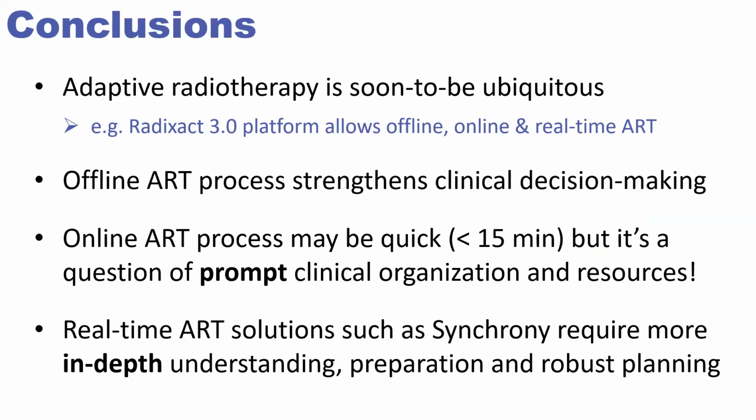So in conclusion, what I wanted to say is, as we've seen, it's soon to be ubiquitous. We're a small center in Lugano, and I have the capability essentially to do all 3 of these. I think every vendor now has products, and if they don't, they're in the midst of releasing them. So adaptive is present. I think offline ART is underrated, and it plays a huge part in confidence in what you're doing. No matter what you're developing, it's really important to seize the offline process and how it overlaps with the other 2, online and real time.